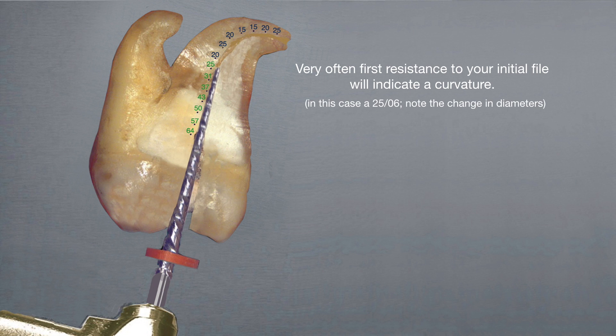Very often, first resistance to your initial file will indicate a curvature. In this case, a 2506. Now note the change in diameters where the file has engaged the canal.